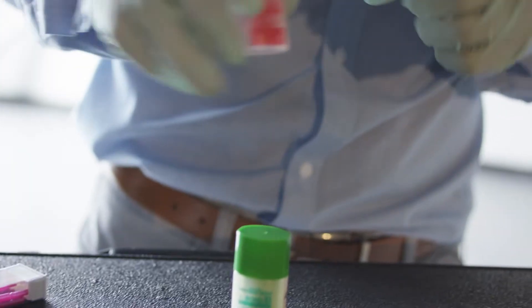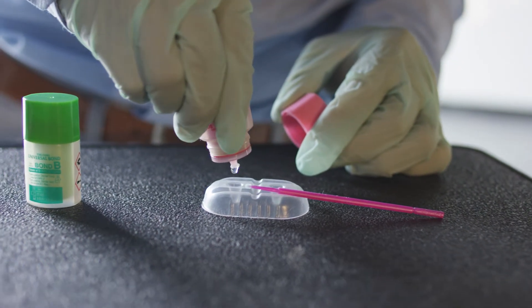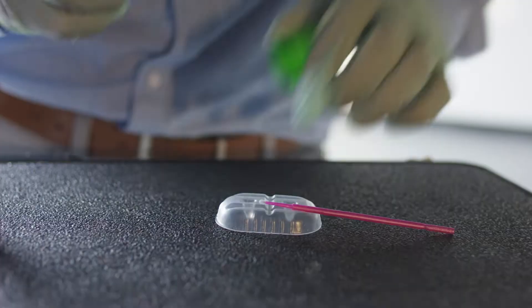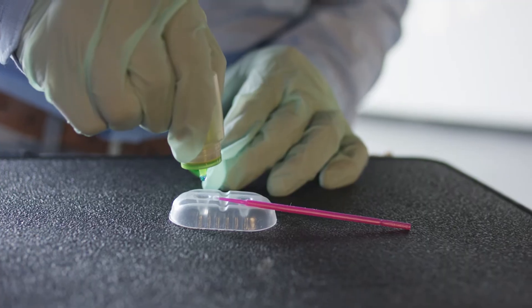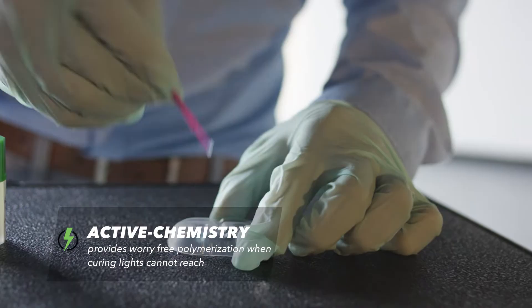Three easy steps: mix, apply, and air dry. One drop of Bond A, one drop of Bond B, and it's self-cured — so no light curing necessary, saving you on chair time.